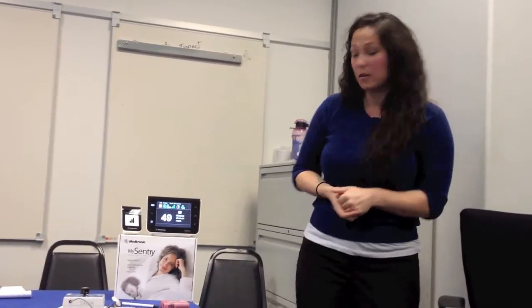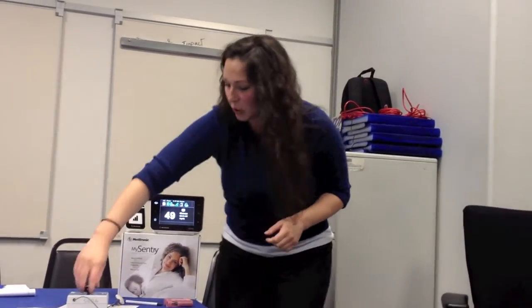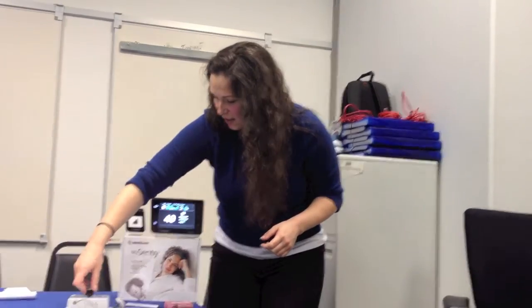Can you turn him up? I'm getting nervous with him being so low. Absolutely. We got it. Now we're all going to experience lows by osmosis.